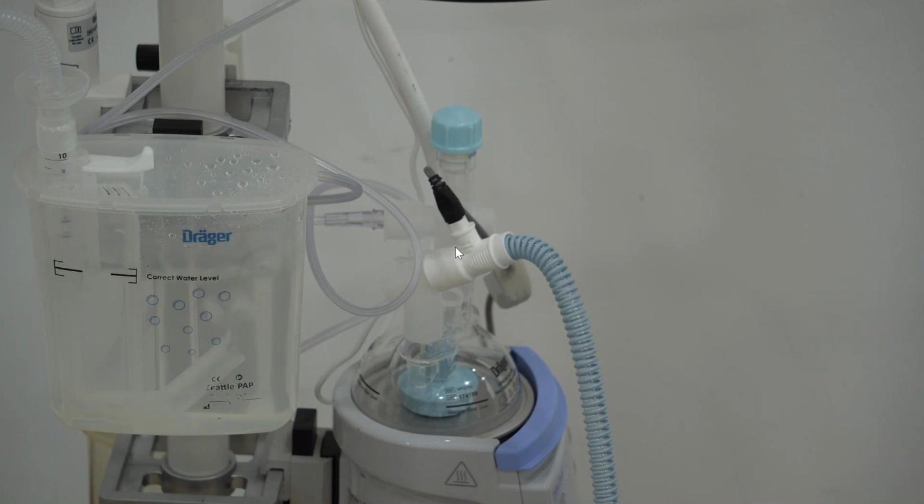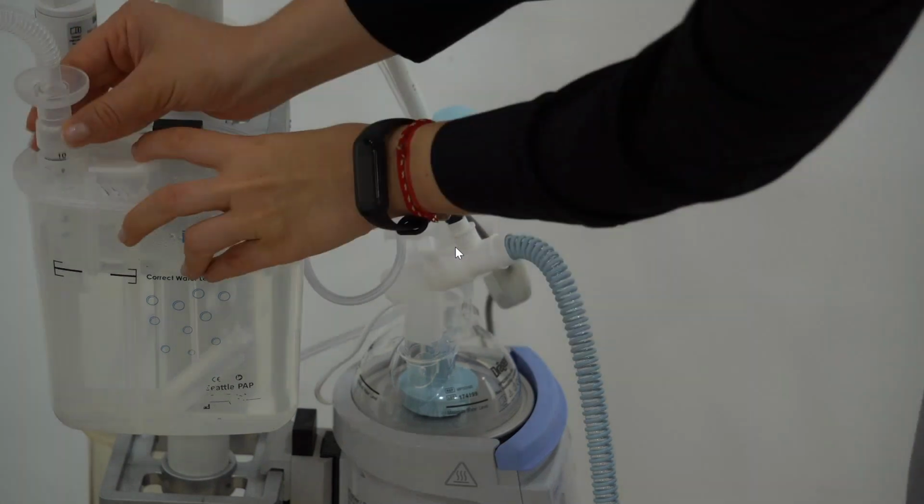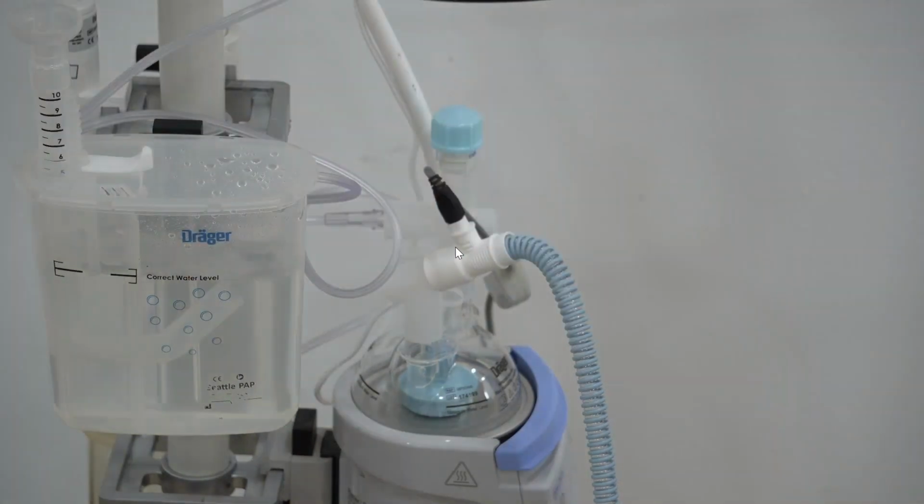This is the name of the ventilation mode, if you would like. PEEP, positive end-expiratory pressure, is the setting that you set on the ventilator and even on the bubble CPAP. So the target, that PEEP, is exactly the same as your target for the CPAP during the CPAP therapy.